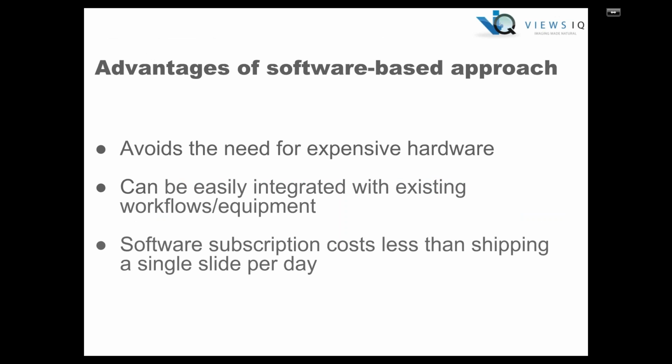Some of the advantages of taking a software-based approach with Panoptic as opposed to a hardware-based approach with whole slide scanners include that it eliminates the need for purchasing that expensive equipment. All you're purchasing is the software itself, a digital video camera, and if your own personal computer doesn't meet the minimum specs, you can source one through us, or we can recommend one.